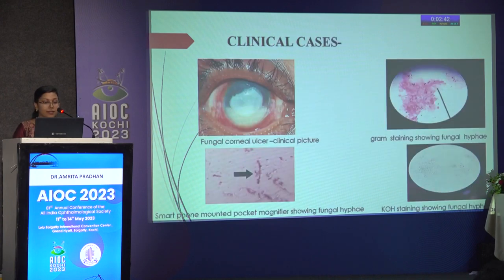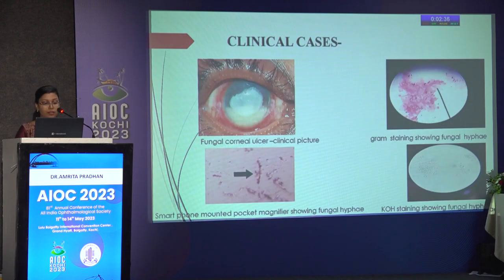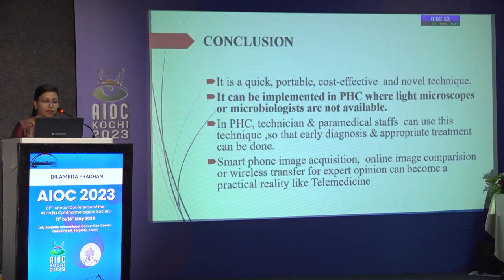These are some clinical pictures. We found here a smartphone mounted pocket magnifier showing fungal hyphae. Coming to conclusion, it is a quick, portable, cost-effective and novel technique. It can be implemented in peripheral health centers where light microscopes or microbiologists are not available.